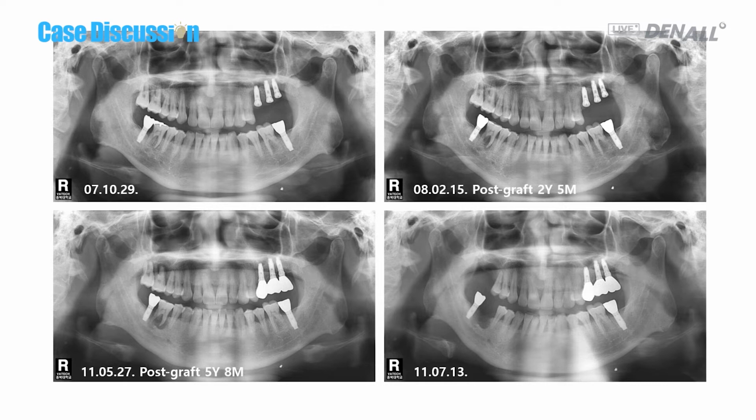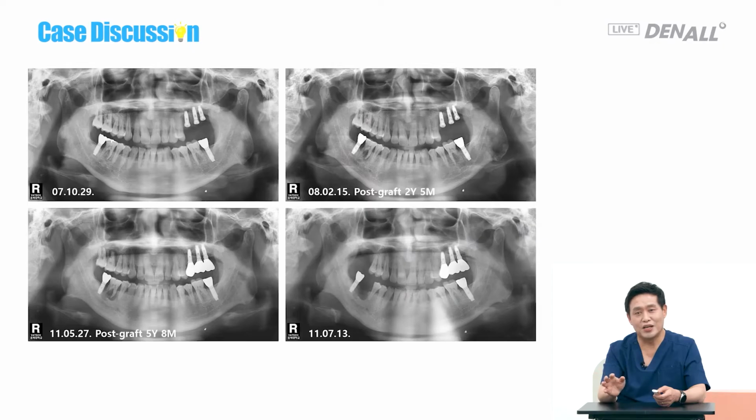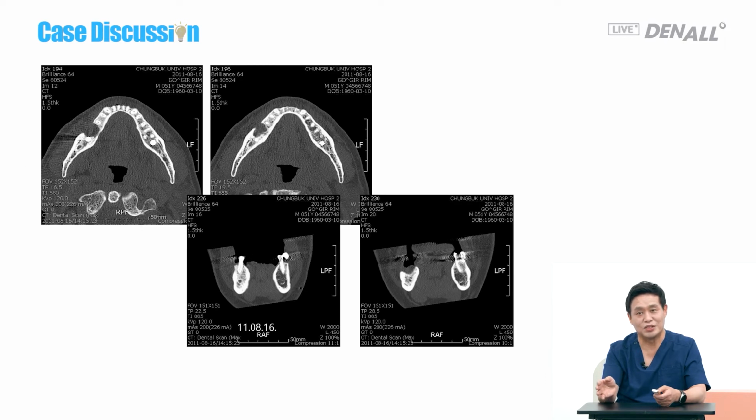It was in May, and after that, it was July 2011, so he was very busy visiting the Kaesong Industrial Park frequently. So I told him I'll do bone graft again here. And he said it was too painful for him when I took the autogenous bone from the ramus before. So there is implanted number 7 and there's number 5. So allogenic block bone is used here.